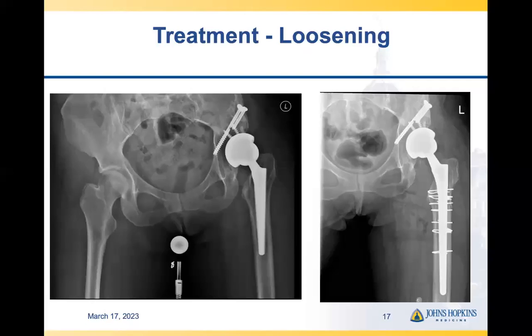So we had to cut the bone very methodically and then put a brand new implant in there, as you can see on the right-hand side, which is a longer implant that engages a bigger area of the bone, and then had to use cables to wire that bone back together so that the patient can put weight on it. In this patient, there was nothing wrong with the socket part or with the other screws up there, so we let that be.